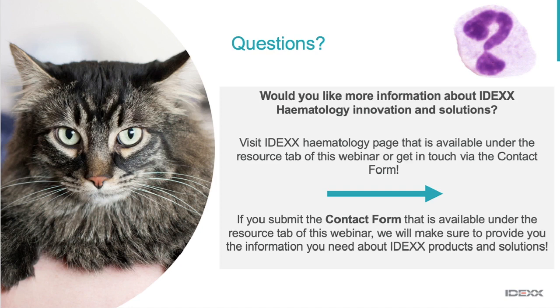And to get there, you absolutely do need to do that new methylene blue preparation and not count them, but just scan the slide. If you easily find many punctate reticulocytes, you can put it into the regenerative bucket. If you don't find them, it's in the non-regenerative bucket. And just like we started with, you go in completely different directions diagnostically. So it's not an uncommon question. It's not an uncommon presentation either.